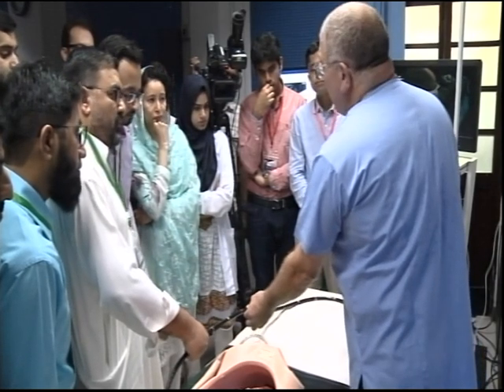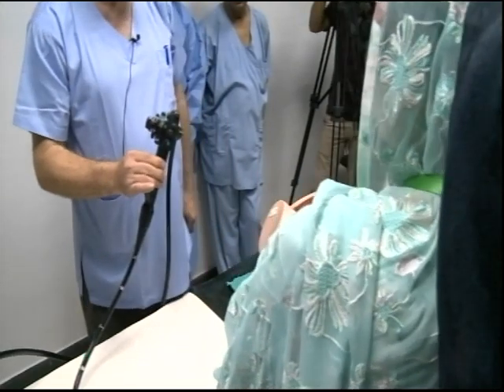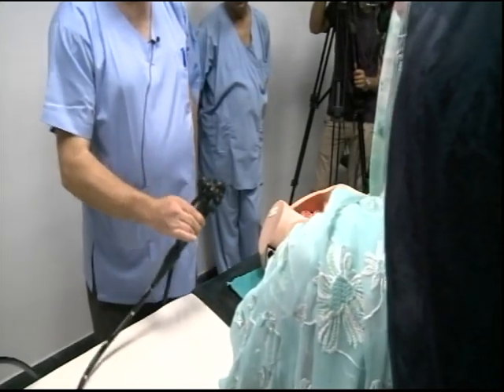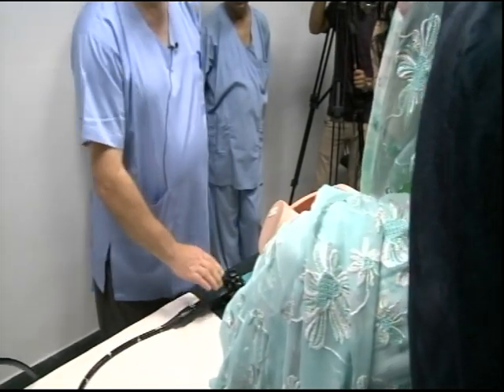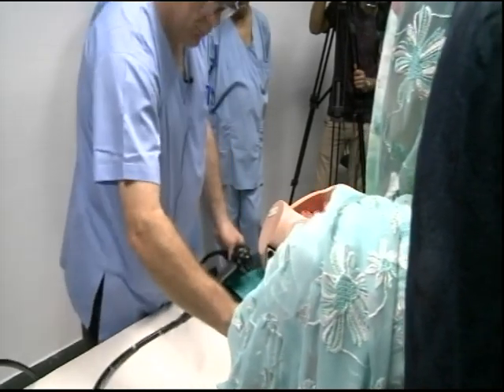So you just hold the scope there. Hold the scope between your fingers. See how loosely that feels? Right? I'm just putting this down. How does that feel? Relax. No, I don't want you to relax. Yeah. I want you to put a lot of torque on.